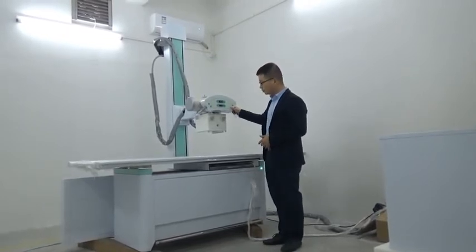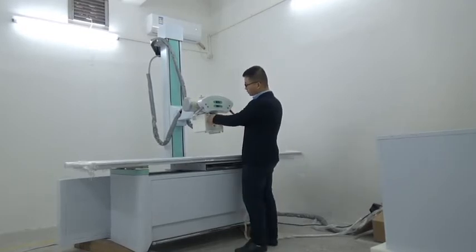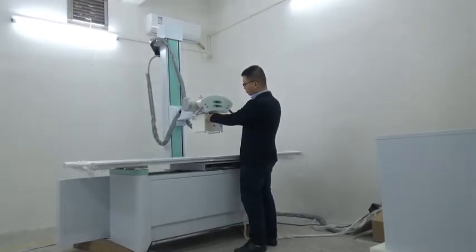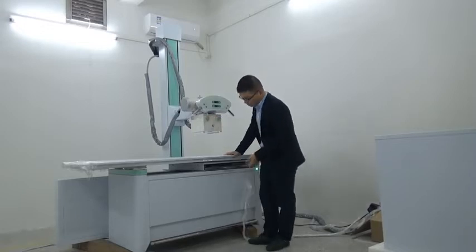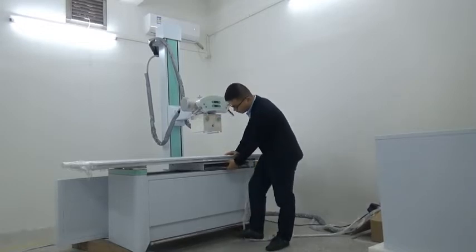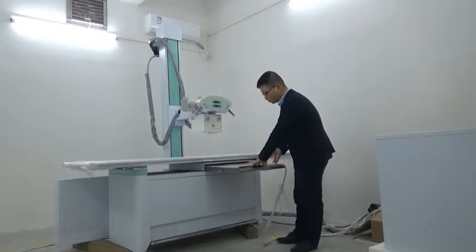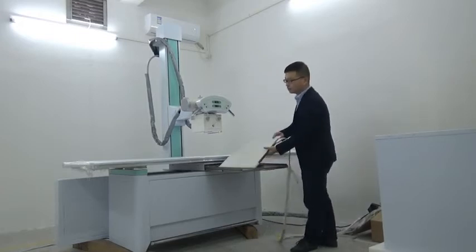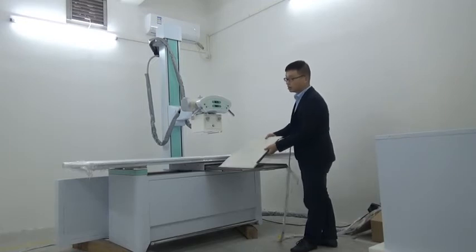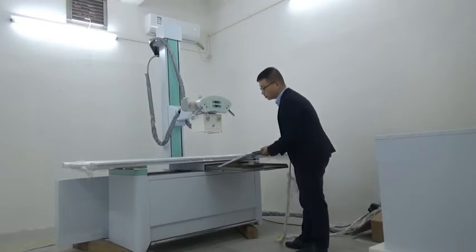The generator is moved by a motor to adjust the size of the exposure field. For the image detector part, we use a 40 by 43 cm flat panel detector. It can be used with the body stand to meet chest radiography requirements.